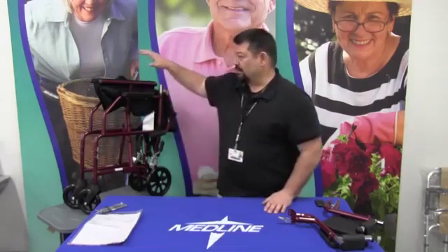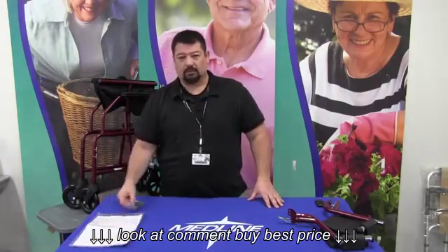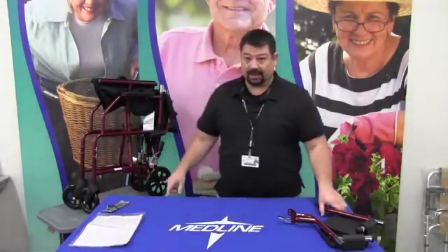The chair comes out of the box with the chair assembly, the owner's manual, a small tool pouch, and the legs.